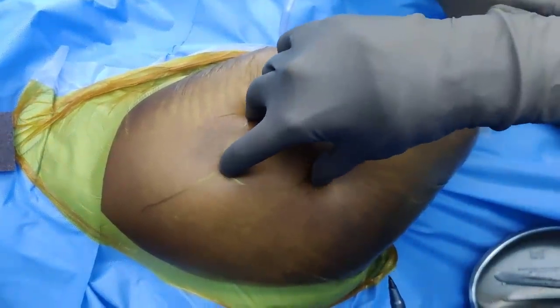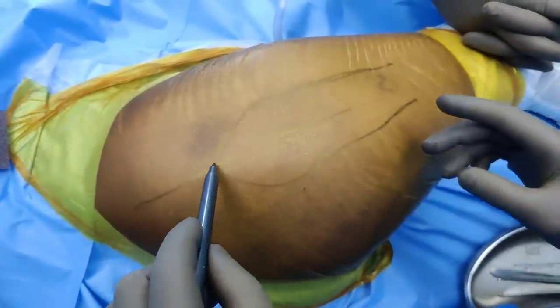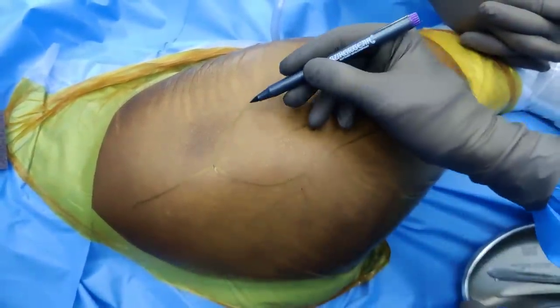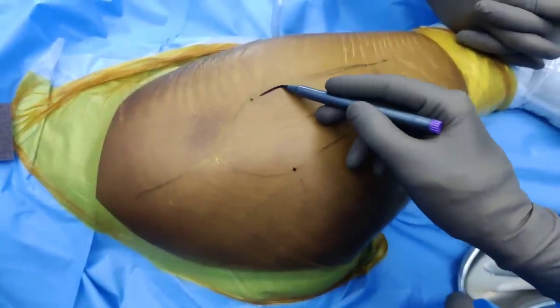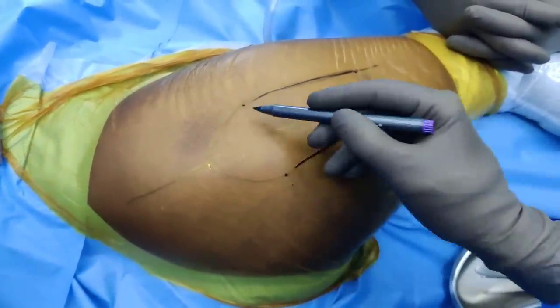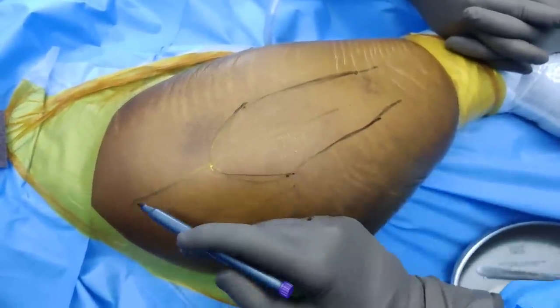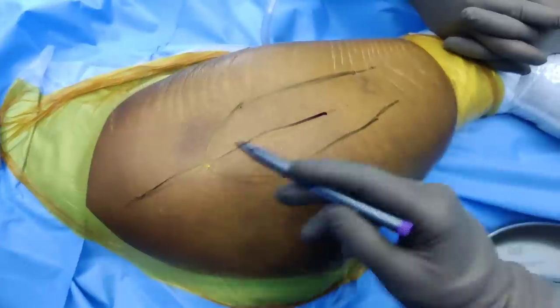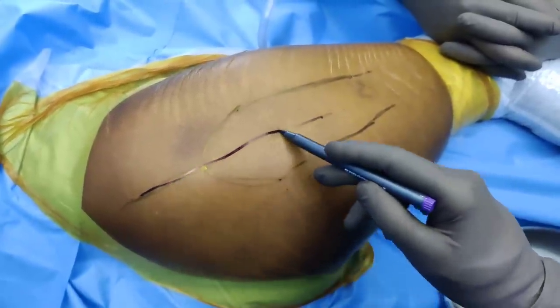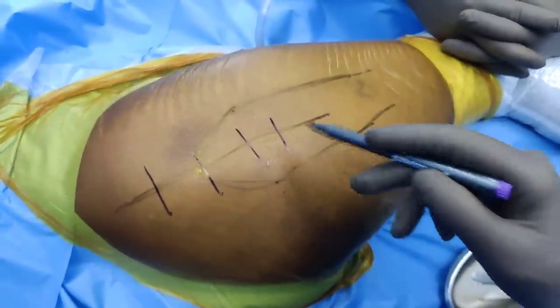This is what I do when I do any operations across the hip. This is the tip of the greater trochanter, this is the front part of the GT, this is the posterior aspect of the GT, and this is roughly the femur. When you do a hip replacement this incision is slightly posterior, but for safe surgical dislocation this is almost a straight vertical incision. That is our marking of the skin incision.